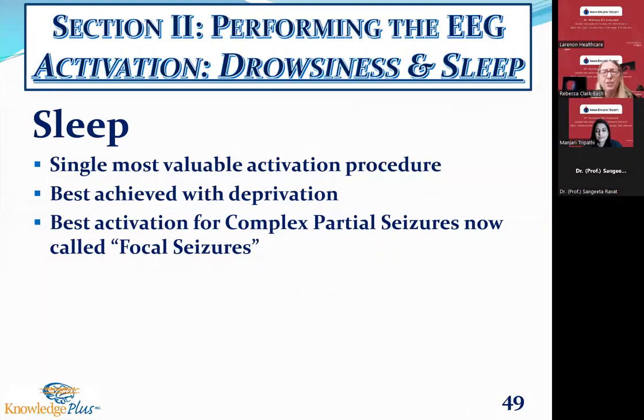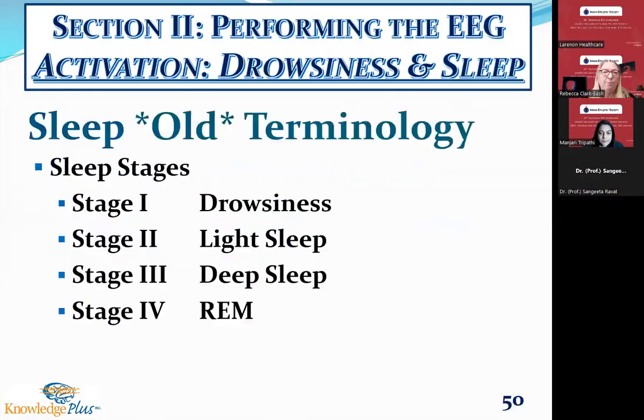And as far as positioning, the only position that doesn't work well with EEG is when some people sleep on their belly with their hands above their heads. That doesn't work for us because it would mess up all the electrodes. But try to get them in as comfortable a sleeping position that replicates what they do back home.